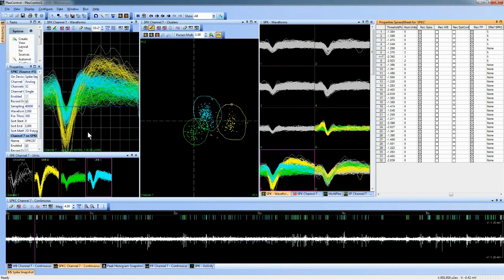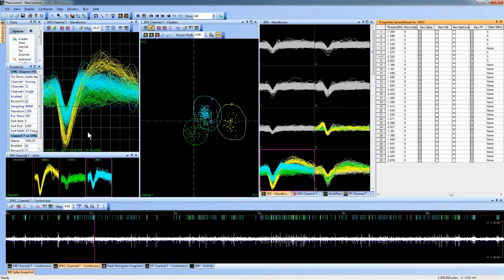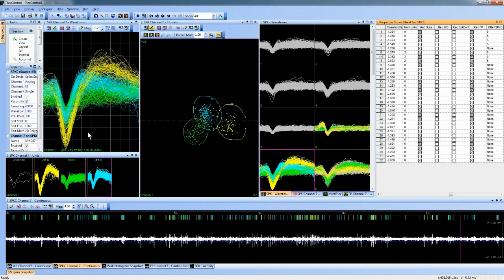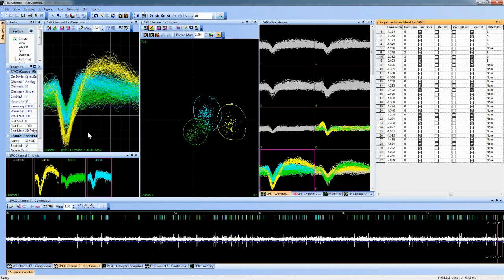Great. Very good answer. Okay, I think we've got time for a couple more here. David has asked, I wish to set a field potential range of 180 to 200 hertz in PlexServer to monitor hippocampal ripples during electrode implantation. How would I do that?